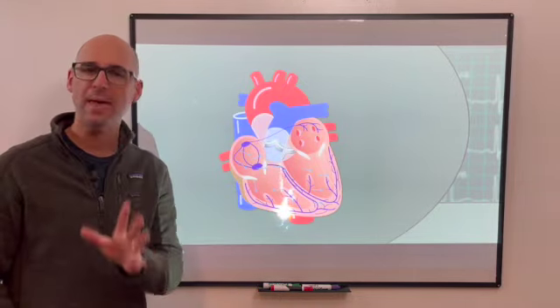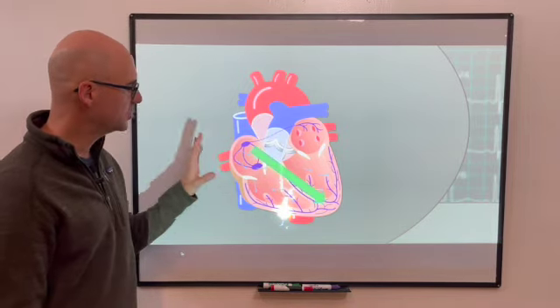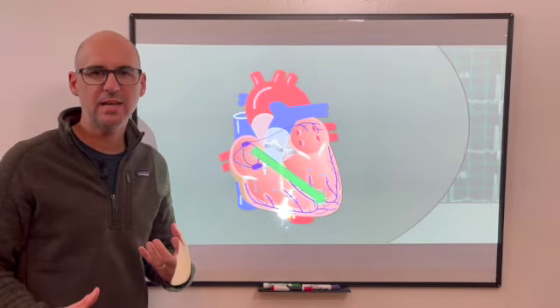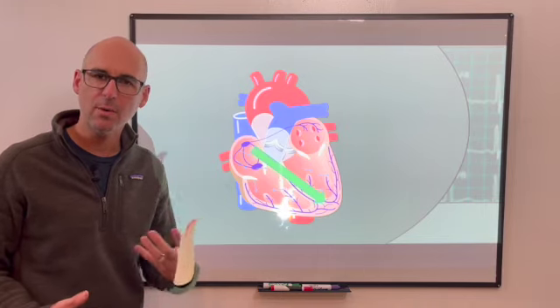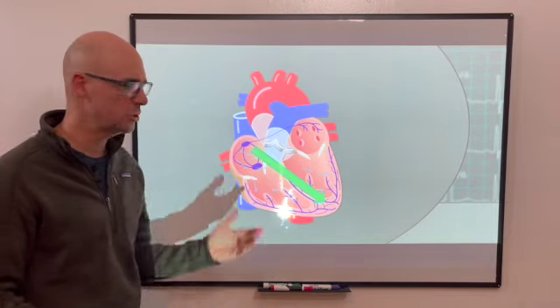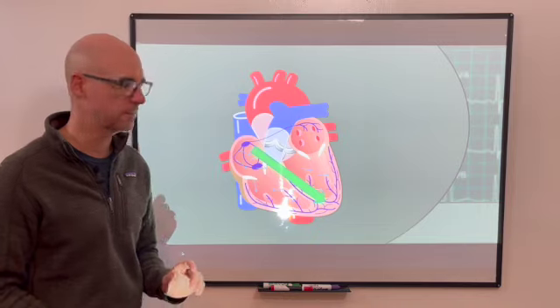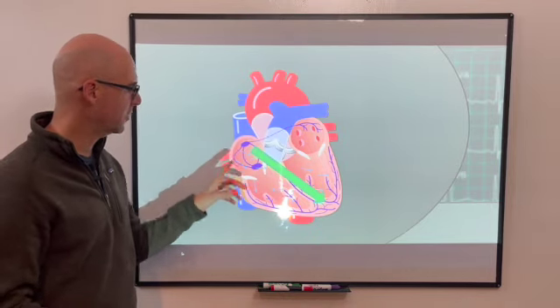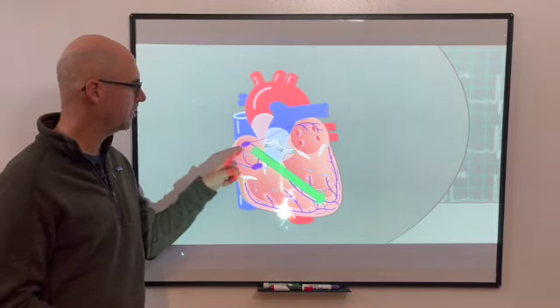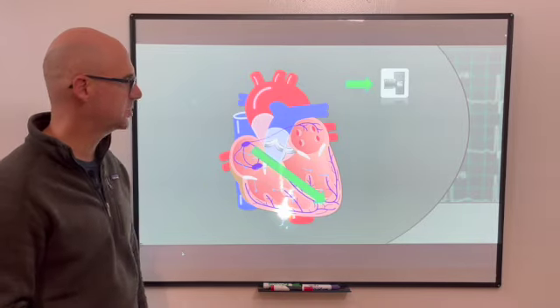Well, we have to remember some basic rules of electrophysiology, okay? The first rule that we have to always come back to is, how is the lead itself, and I often refer to this lead as a camera, because that's kind of how they operate with our 12 leads, in relationship to the average direction of depolarization, all right? And as we go back to our basics, we'll refer to the average direction of depolarization as starting up here in our SA node and then finishing down here in the apex of that left ventricle.